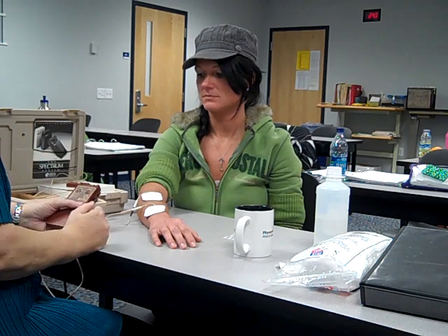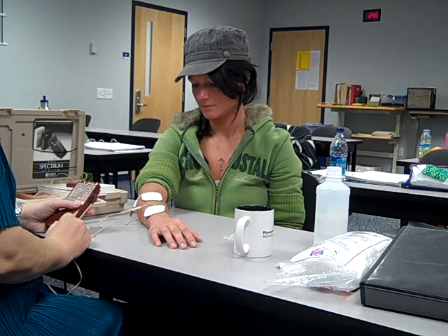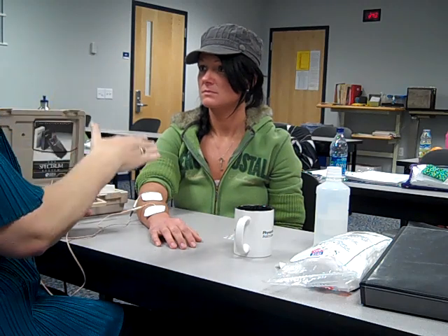What's the other thing I need to do in this little panel? Change it to multi. Tell your patient again before you start clicking things. Next thing I'm going to do is change it to multi. What that's going to do — you feel the sensation right now — it's going to make it go less and then come back up to that sensation, then go less and back up again. It won't get any stronger than this. And what that does is it keeps your body from accommodating, getting used to it. So I'm going to change that — and there it is. It'll take just a second, then you feel it go down and back up. Have you felt it yet? Yep. So that's where we're going to leave it.